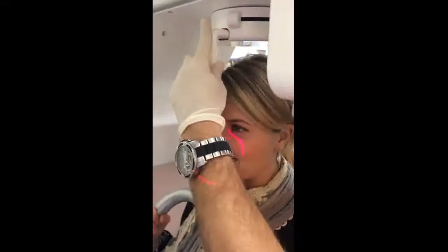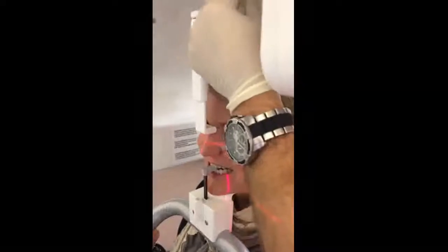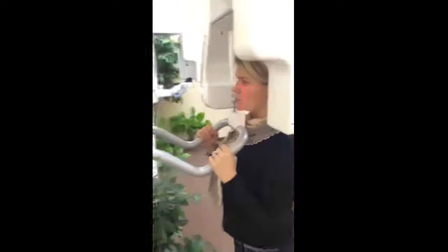At that point, bring your Nasion support in, lightly touch the patient, close your temple supports, ask your patient to close their lips, swallow and hold their tongue to the roof of their mouth, and take your pan. Thank you very much. This has been your training on the Cranex Novus E.